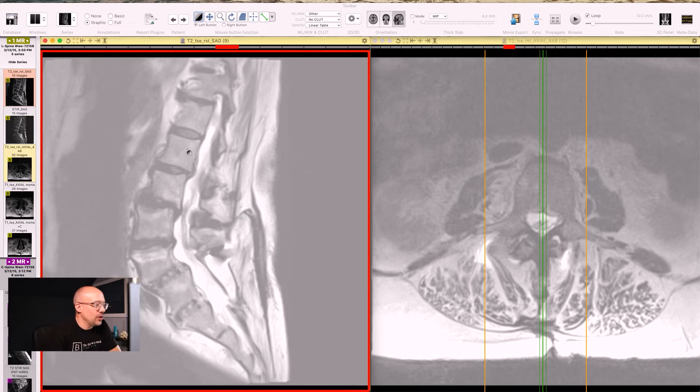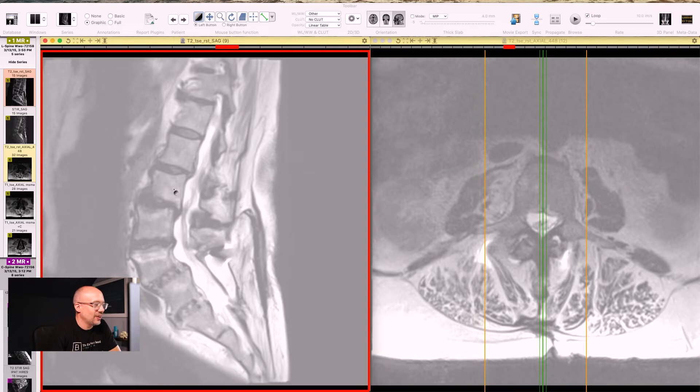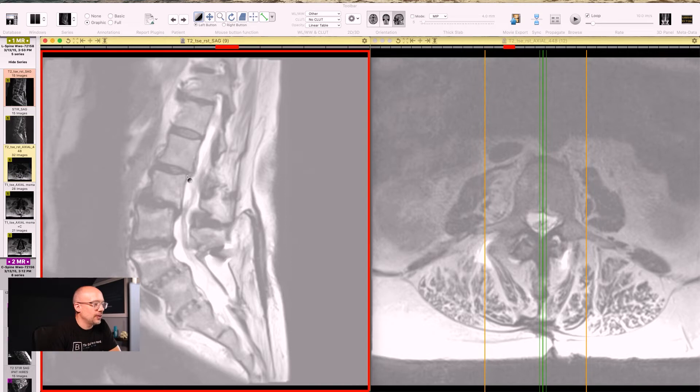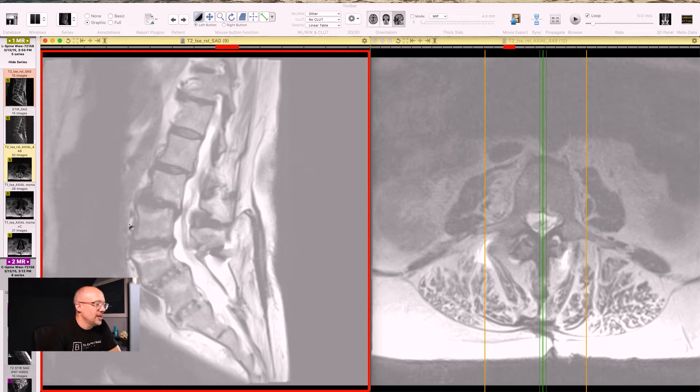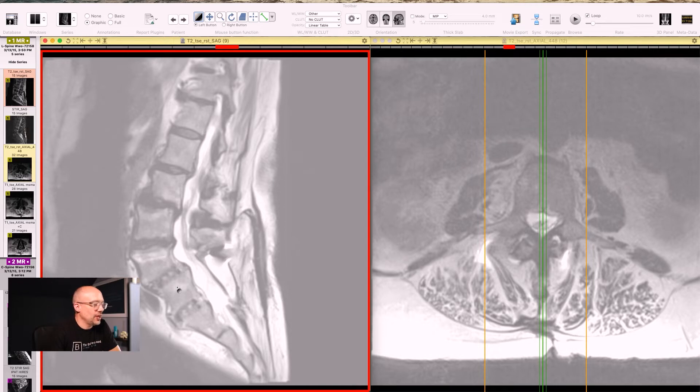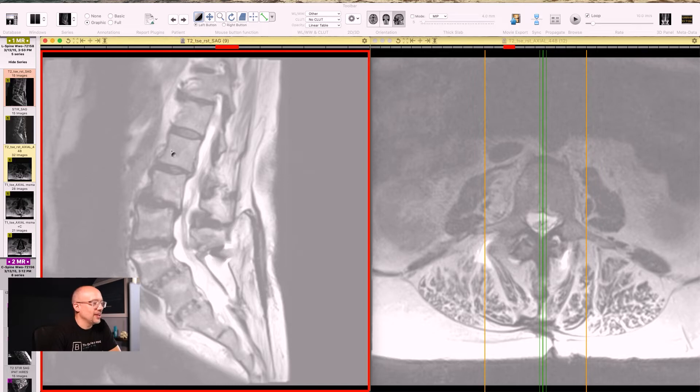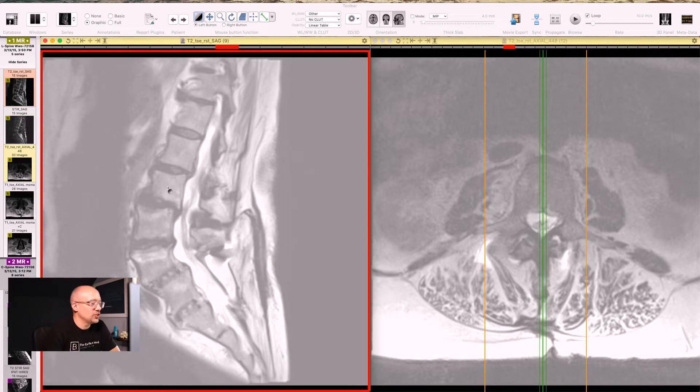But one thing that you will notice as we go down is these things start to look sloppy and different, right? That disc, instead of residing nice and underneath the bone, we see multiple areas where the disc is poking out the backside. Look at those, I call them the beak, right? Poking right out the backside and or out the front. So we have degenerative changes at L5, S1, L4, L5, L3, L2, L1, L2, and even T12, L1. So we had a lot of degenerative changes throughout the spine.